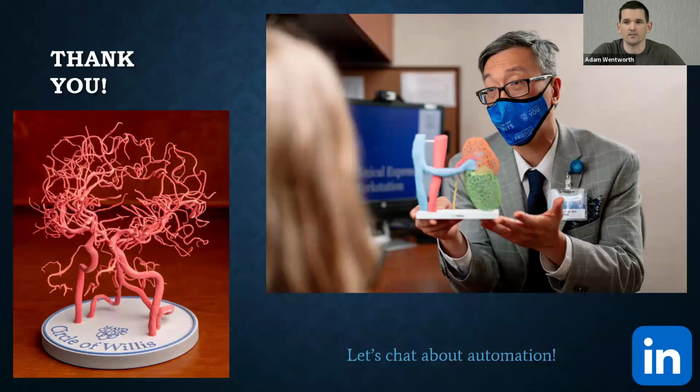slicing thin slices. So yes, we do have specialized protocols for kidney and many other things when orders come in and tying to the patient record to make sure that quality is there from beginning to the end. For AI segmentation specifically, I will say we do work with a third party and that training data has been generated by us. So our gold standard segmentation data has gone in to train those models. So we have a hand in making sure that the quality was high enough for training as well.